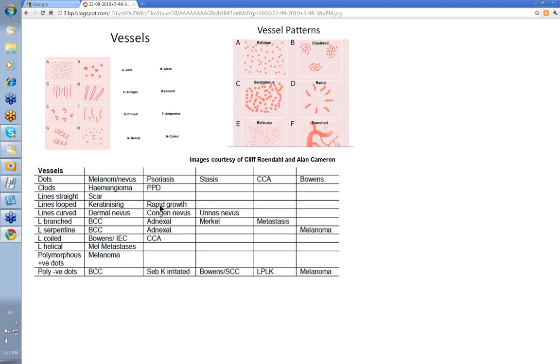Looped ones we've talked about with keratinizing tumors and rapid growth. Curved ones you see in a dermal nevus or a congenital nevus — Unna will show an example of that. The branched ones are serpentine but branched as the pattern: BCC and some adnexal tumors, but also in rapidly growing Merkels and metastasis. Serpentine again in BCC and adnexal, coiled in Bowen's and clear cell acanthoma.